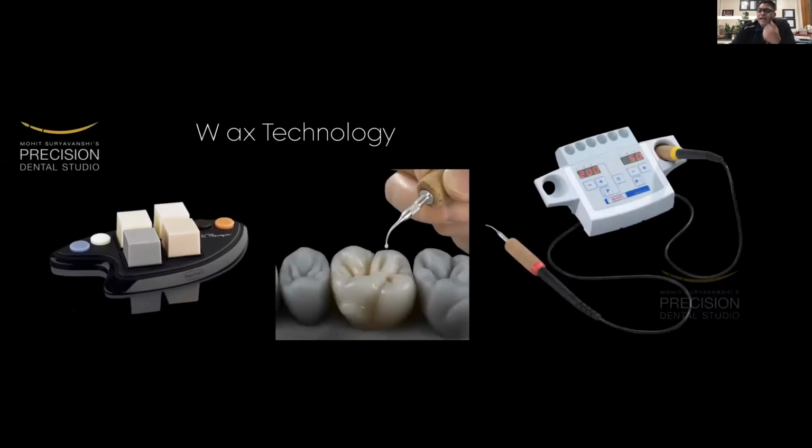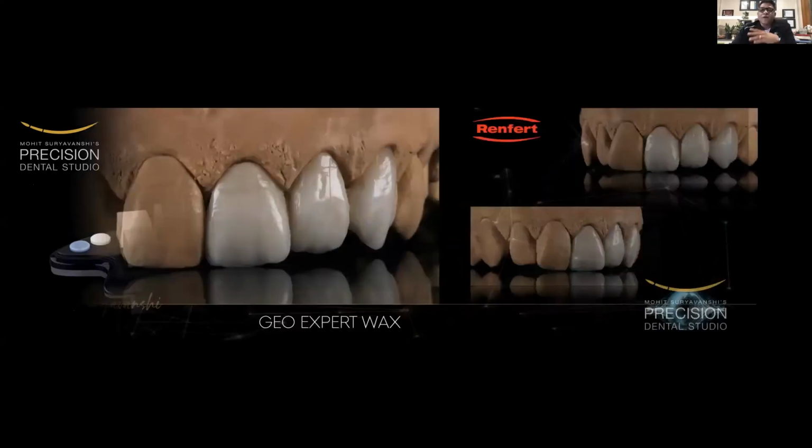And the gadget on the right hand side is a must-have gadget, the wax electric from Renfert, and we have almost 10 in our office. This is the best instrument that everybody should possess to exercise, to learn, and to wax it up.